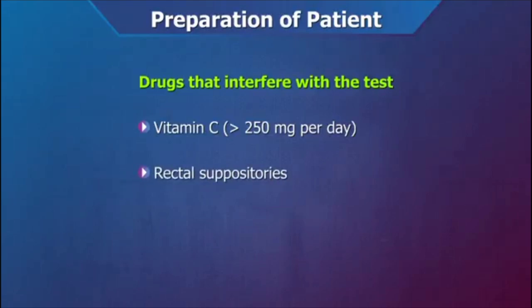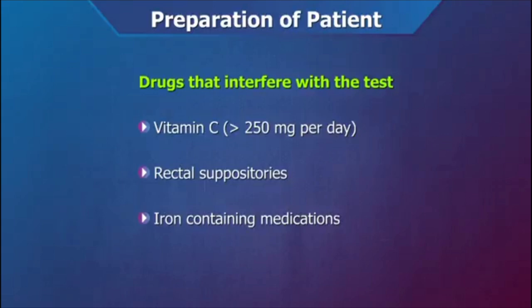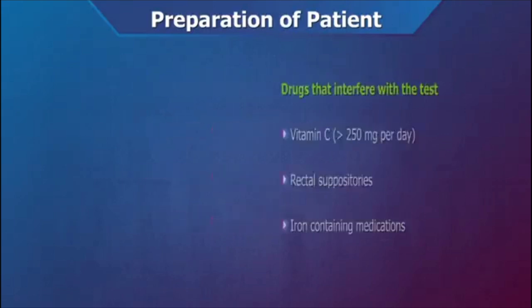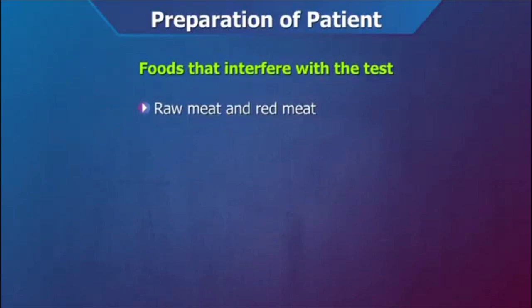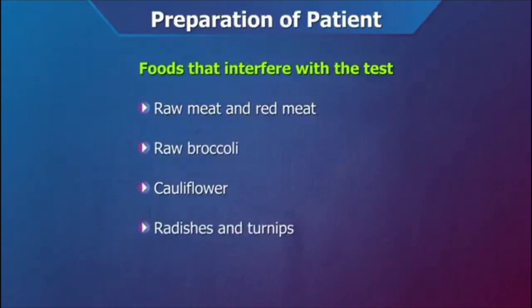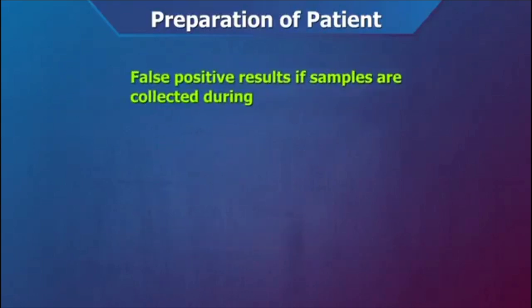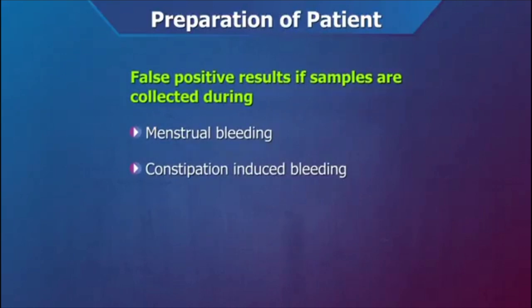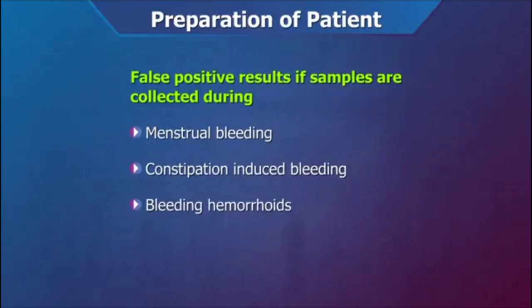Rectal medications such as suppositories and iron-containing medications may also interfere with these tests and should be discontinued 2 days before and during the test period with the consent of the physician. For at least 2 days before and during the test period, all raw meat and red meat should be avoided. Raw broccoli, cauliflower, radishes, and turnips may cause false positive results and hence should be avoided. Stool samples collected during menstrual bleeding, constipation-induced bleeding, bleeding hemorrhoids, or when rectal medication is used may also cause false positive results.